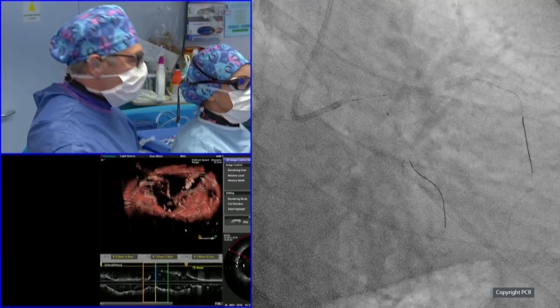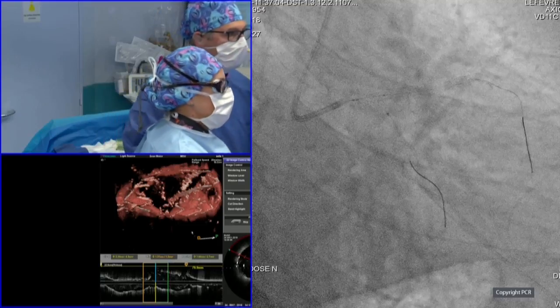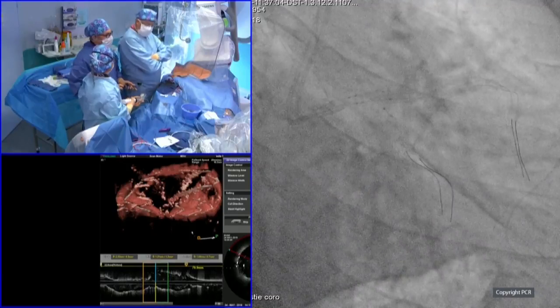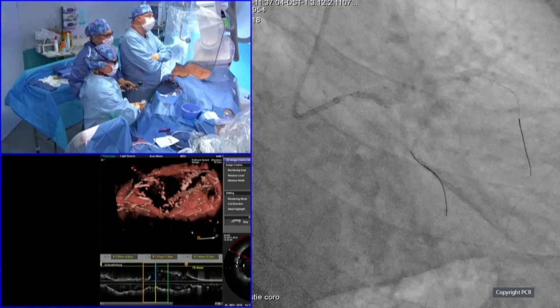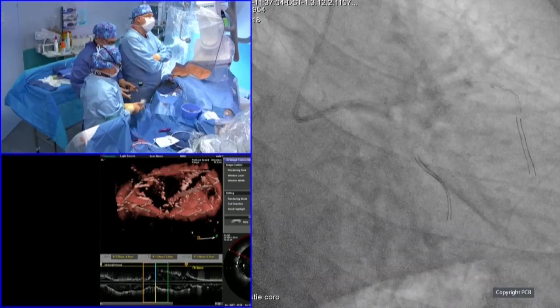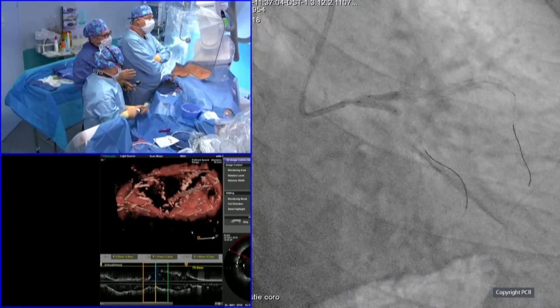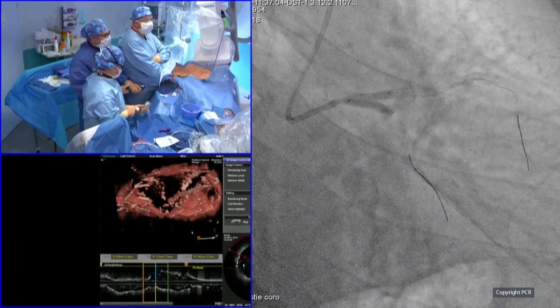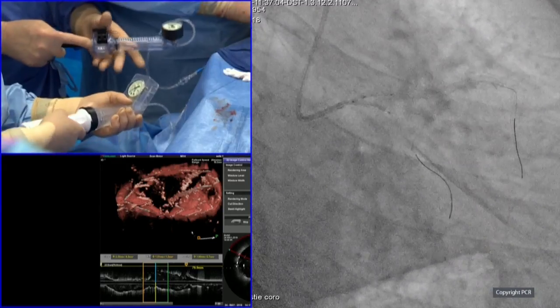Okay. Perfect. So do you want to inflate? We are going to open the side branch. Thierry, are you going to do a symmetrical balloon inflation like you taught us to do? We start by the side branch usually. So this is a non-compliant balloon. I'm going to 12. Now we inflate the main. And we try not to touch too much the proximal polygon of confluence. It's okay, Bernard? Okay. Deflation. And we deflate simultaneously the two balloons.